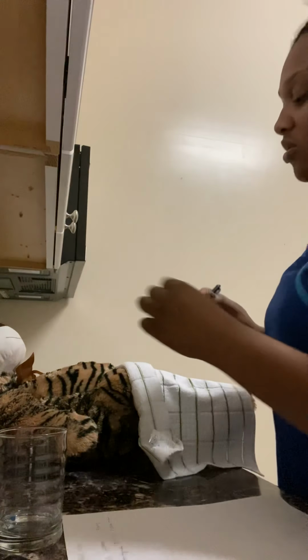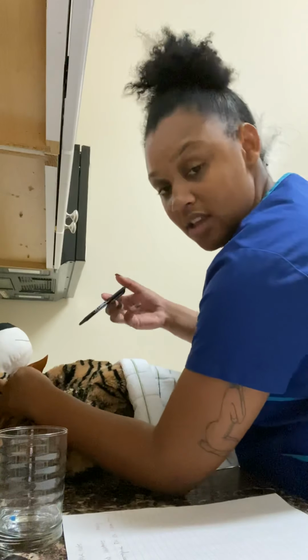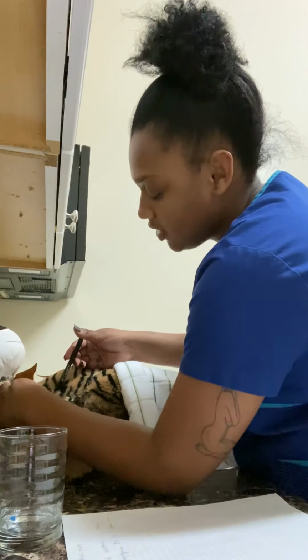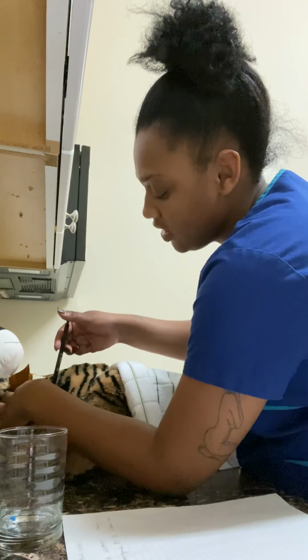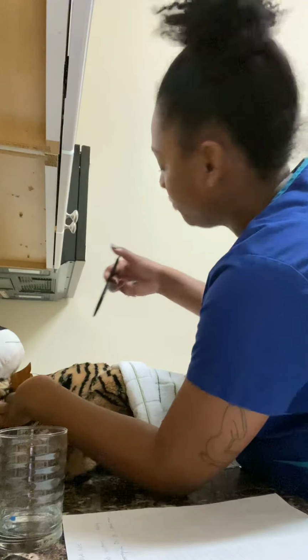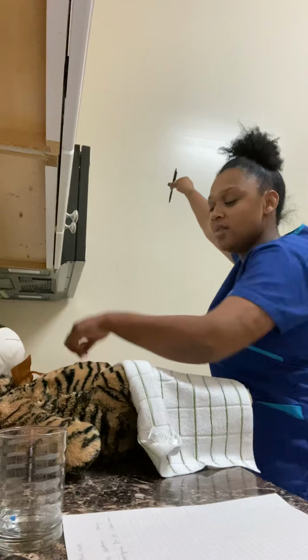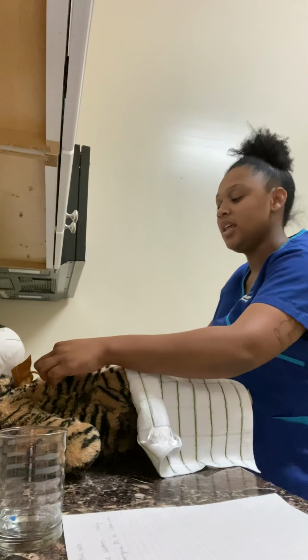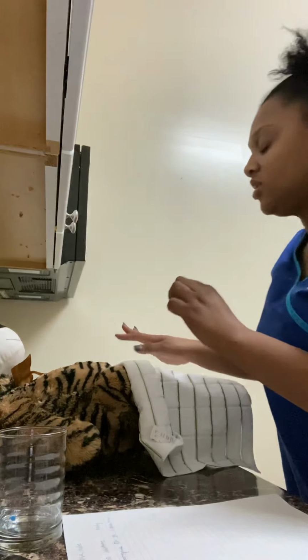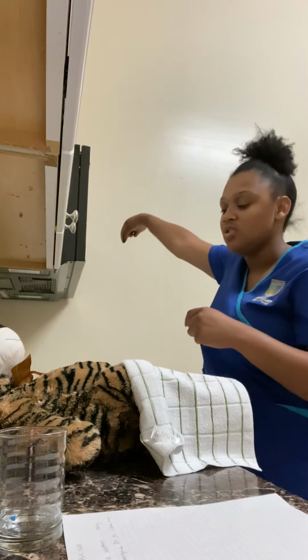I will then hold the subcutaneous tissue with a grip to see my area, and insert the needle at about a 45 to 90 degree angle. Let go of the tissue as I'm placing the needle in. Relax with my non-dominant hand holding it in place. The injection is done, I'll pull it out at about the same angle. Disregard that into the trash bin. Use a cotton ball to stop any bleeding. Now I'm going to inspect the area, make sure there's no swelling, any onset of rashes or anything. Disregard that into the trash bin.